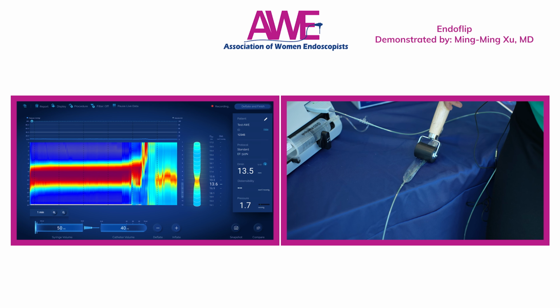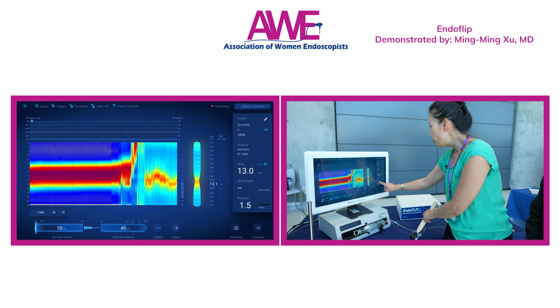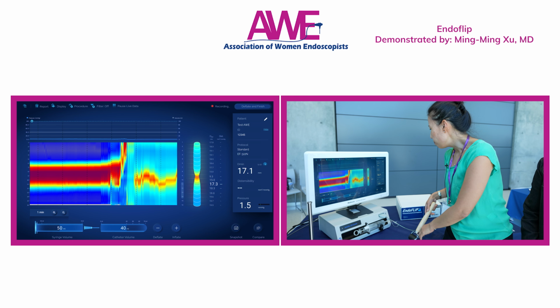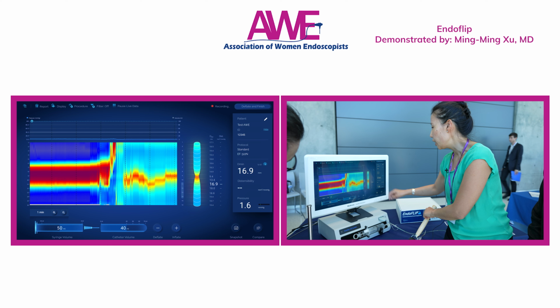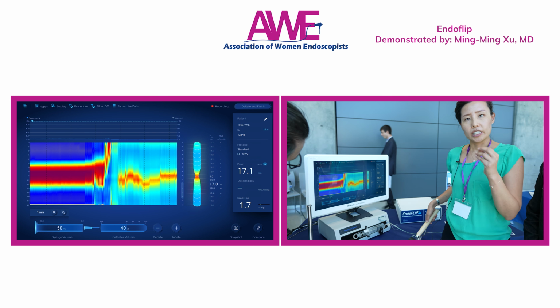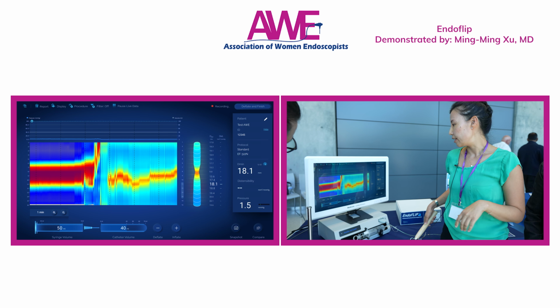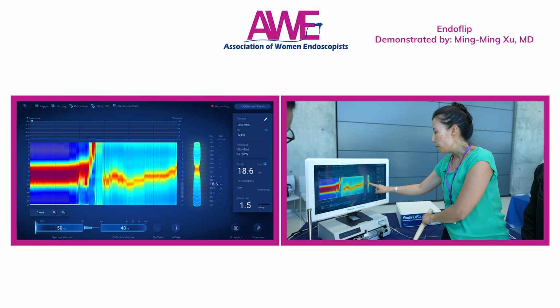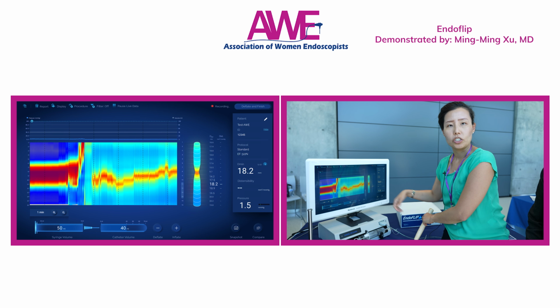Normally there is a read on the distensibility. I'm not sure why it's not popping up, but the distensibility index is not being read out here. There is a distensibility index that's normally here. The distensibility basically tells you about the compliance at the LES, essentially the pressure measurement at the LES. And the diameter is the actual diameter of the lumen at the point where the high pressure zone is.